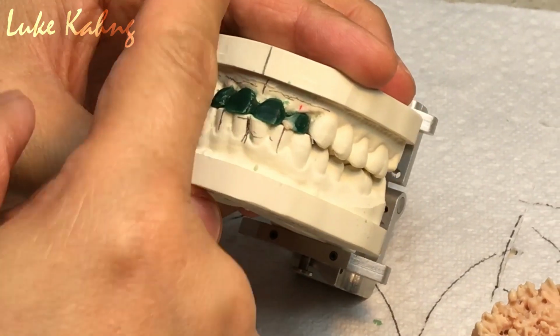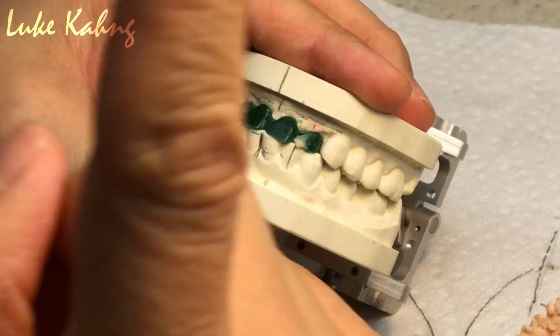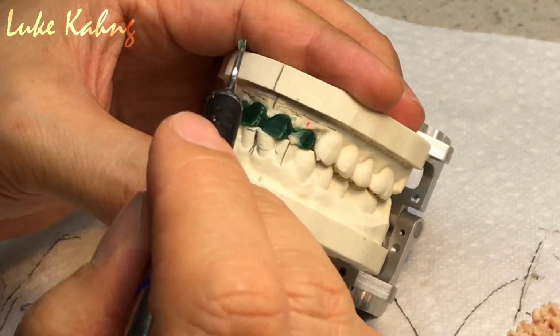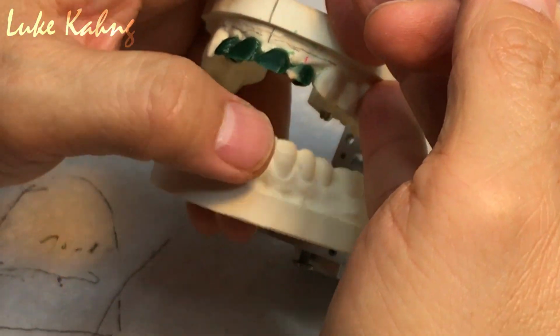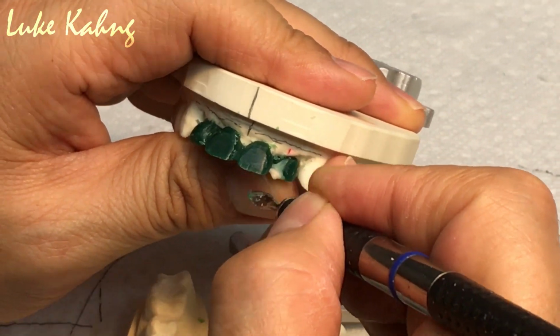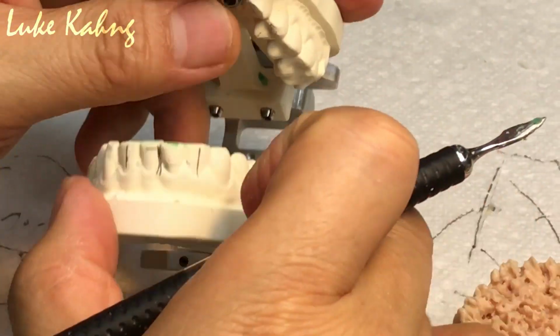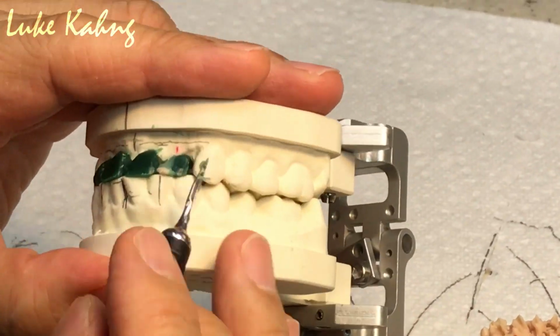So not only the midline size, but also the horizontal line, because the central is longer than the lateral. So I do not like it here. Cut it. That's good. Now this one, cut it a little bit. This is the final. Now it's a little bit fat, so I cut it a little bit.